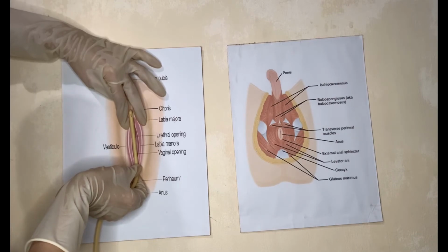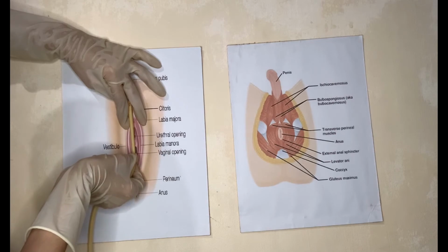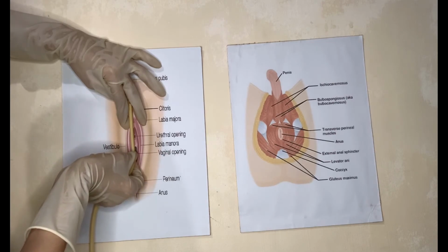If the client complains of discomfort, immediately withdraw the instilled fluid, advance the catheter further, and attempt to inflate the balloon again. Pull gently on the catheter until resistance is felt to ensure that the balloon has inflated, and to place it in the trigone of the bladder.